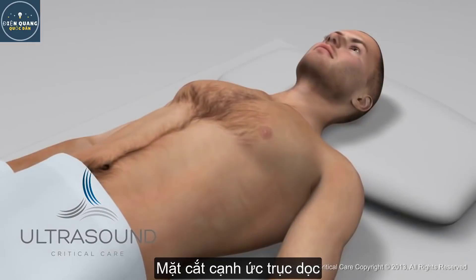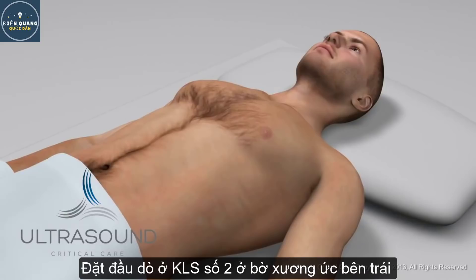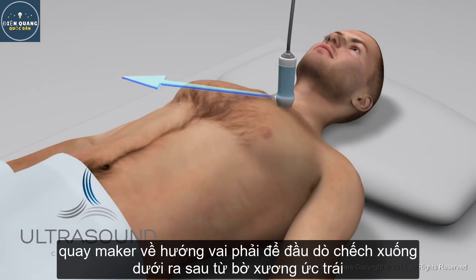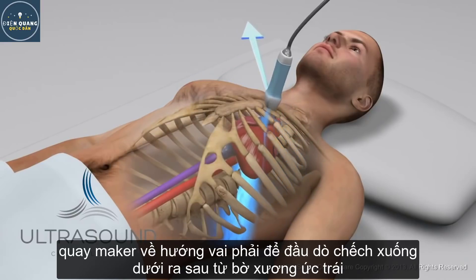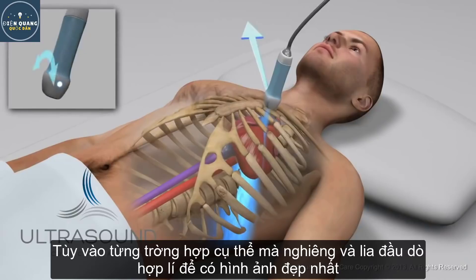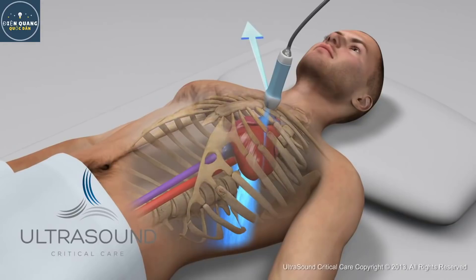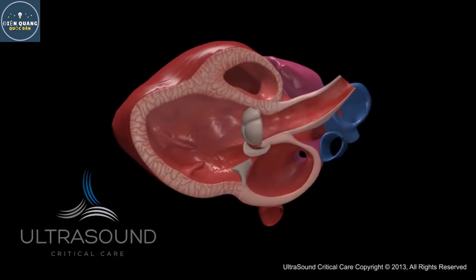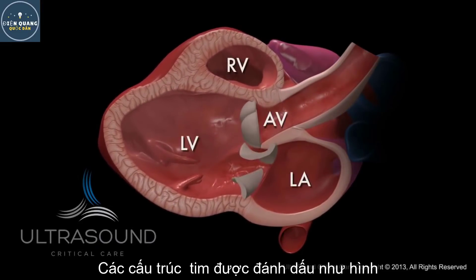The parasternal long axis view. Begin by placing the probe at the second intercostal space at the left sternal border. The dot will be pointing in the direction of the patient's right shoulder. Scan down the left sternal border until the image comes into view. You may need to tilt or rock your probe to obtain the best image. Note the chambers are labeled for each structure.